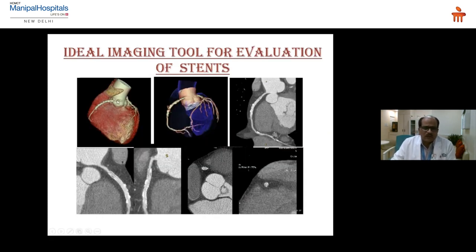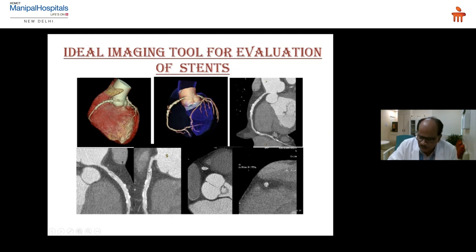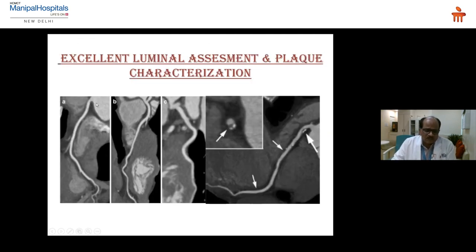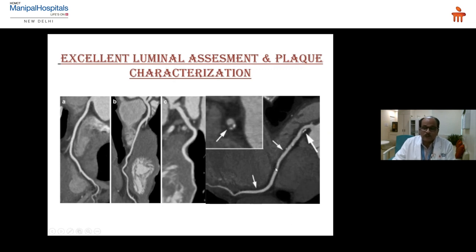This is a case that came with a stent — a chest band CT scan was done. You can see a long stent in the RCA. In the proximal part of the stent, there is a thin lumen surrounded by hyperdensity around the stent — very well visualized. This is nothing but in-stent hyperplasia. CT also allows excellent luminal assessment — you can see plaques, various eccentric plaques, types of calcification, and percentage of luminal narrowing.